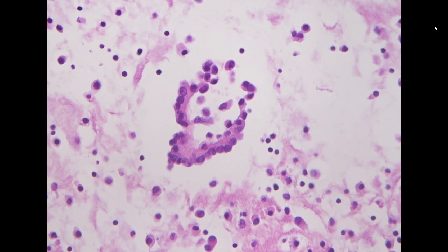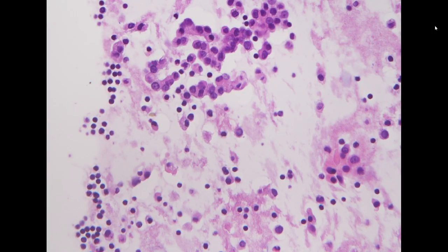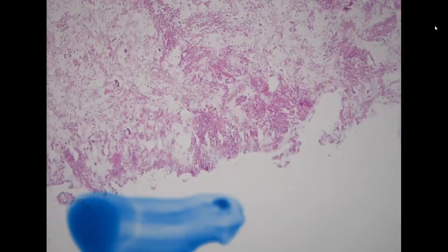So definitely, if we are dealing with, for example, pancreas cancer, this could be a pancreas cancer, right? But if we are dealing with squamous cell carcinoma, this won't be a squamous cell carcinoma. If we are dealing with lung adenocarcinoma, this could be yes or no. Usually the lung adeno will have more prominent nuclear atypia, but this one shows very bland looking. We still need some tests to confirm the origin. So originally the cytotech thinks this is a metastatic adenocarcinoma.